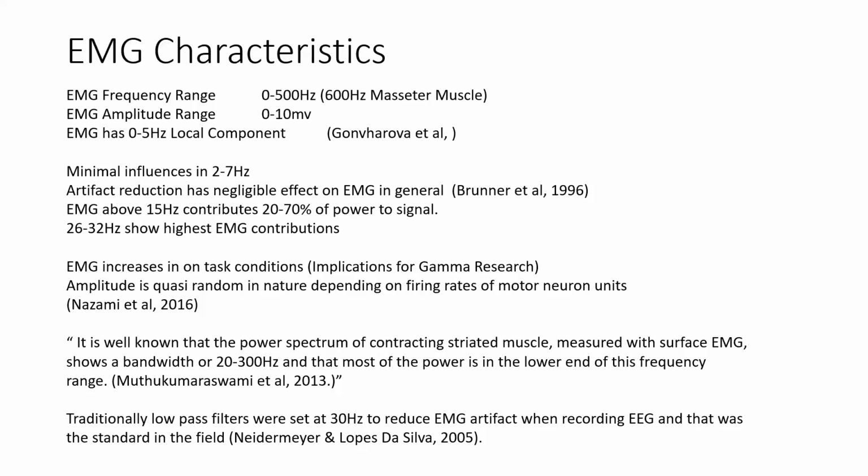Now, traditionally, low-pass filters were set at 30 hertz. That's what Niedermeyer recommended. That's what all the medical work was done with. That's the majority of the EEG that has been done until, I'd say, the last decade and a half. People started looking really seriously above 60 hertz, above that noise from your wall socket. And they said, oh yeah, there are frequencies up there, because the amplifiers got so good and they were able to put electrodes in people's heads and measure without the muscle tension and say, yes, there are higher frequencies.